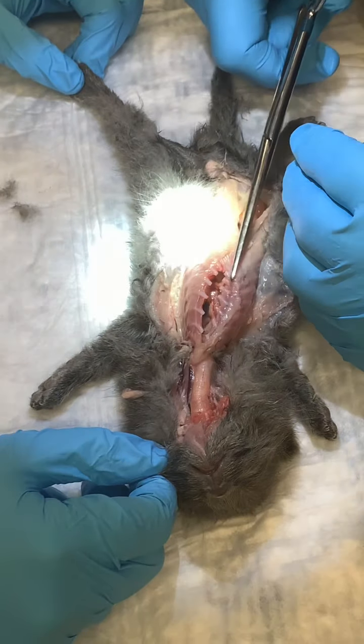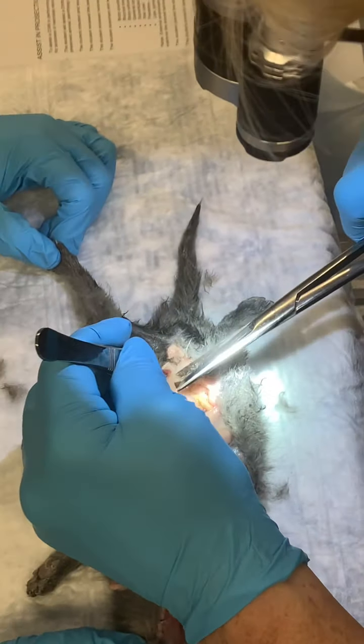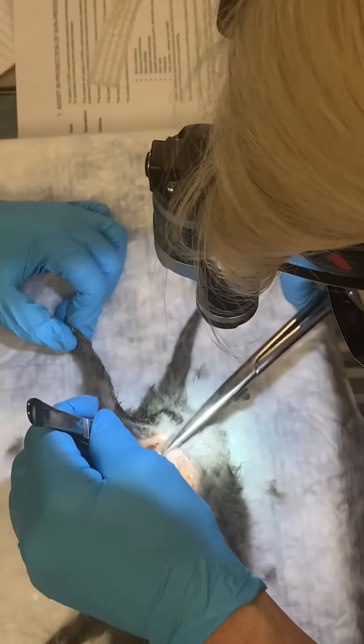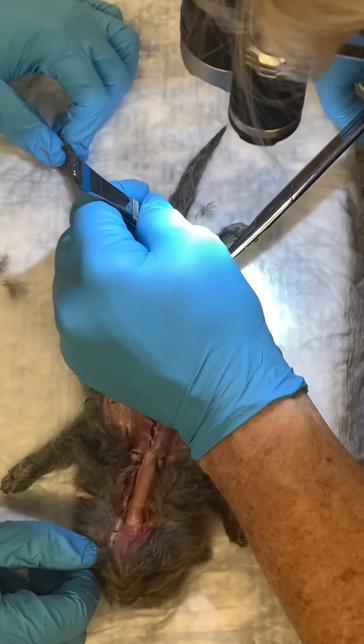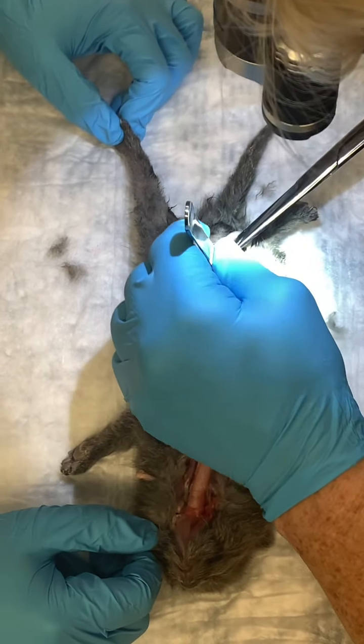So now we're entering the abdominal cavity. And what is this? Male. Just the bladder.